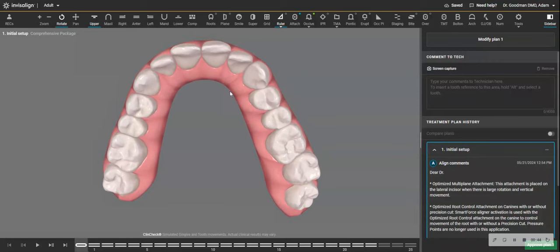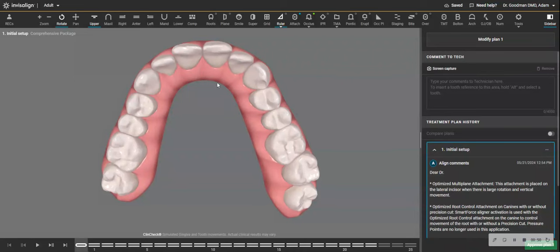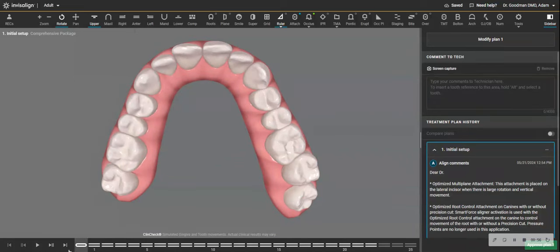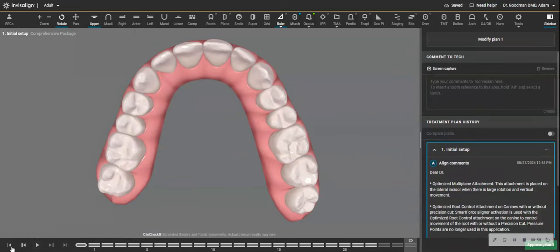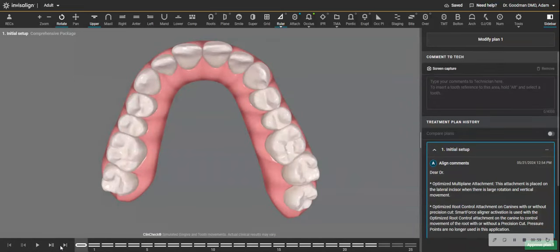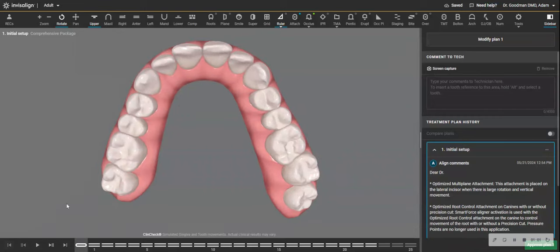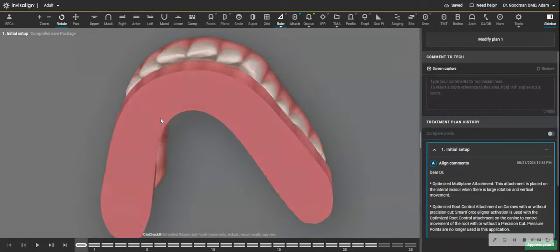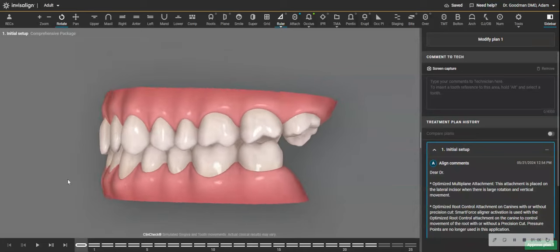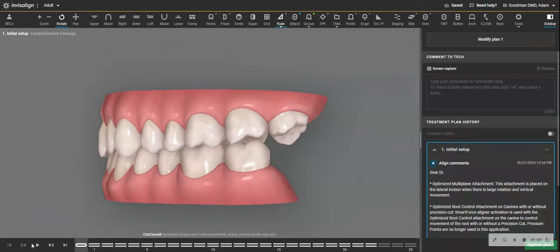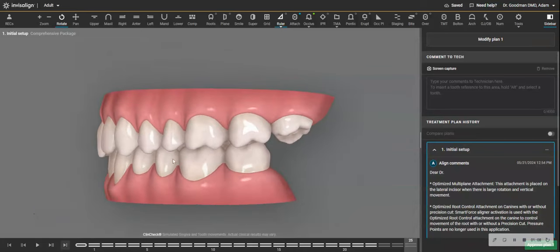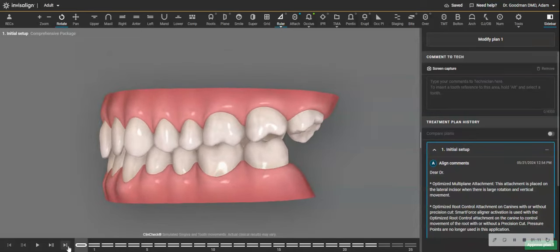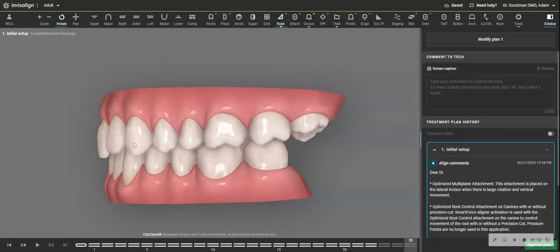Modern orthodontics favors expanding the arch in order to get room to align the teeth. Now, the ClinCheck comes back, and if you notice, the expansion is occurring bilaterally through even to the second molars. Even the third molar on the upper left is moving in this plan, as are the second molars and the first molars.